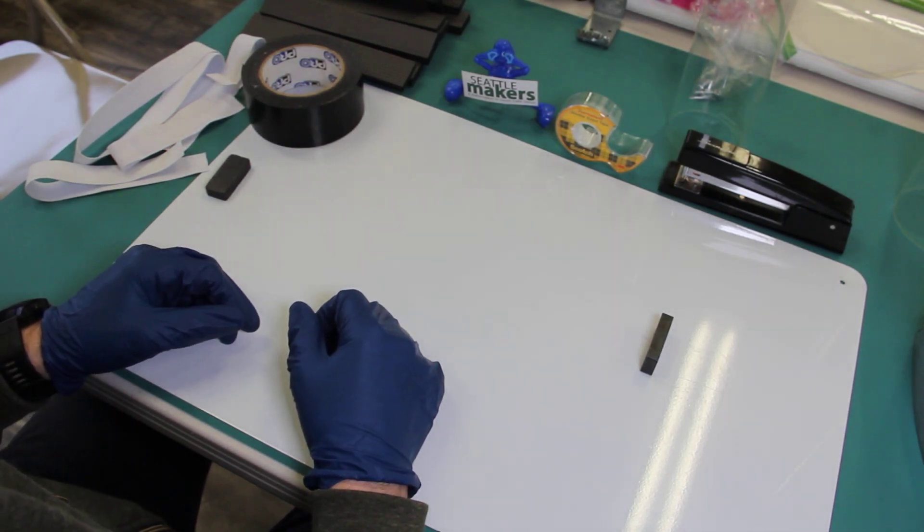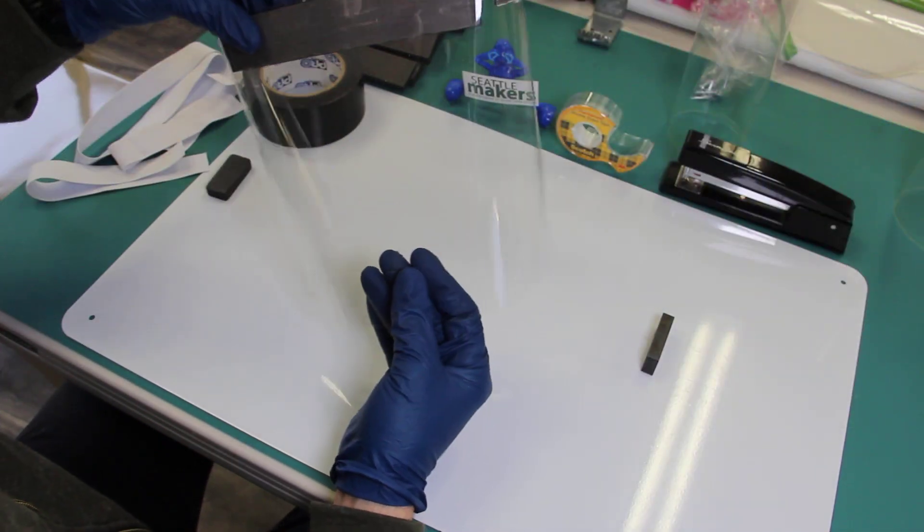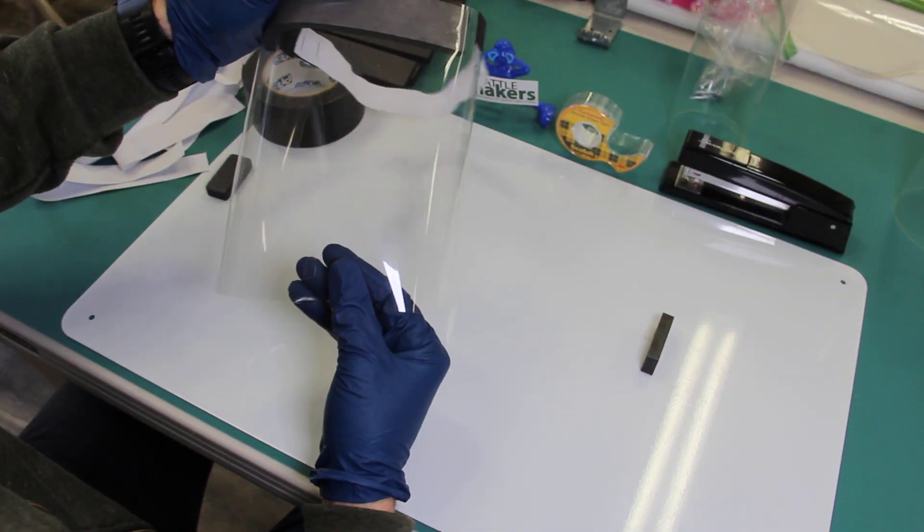Hi, my name is Jeremy Hansen, co-founder of Seattle Makers, and today I'm going to show you how to assemble one of our laser-cut face shields.